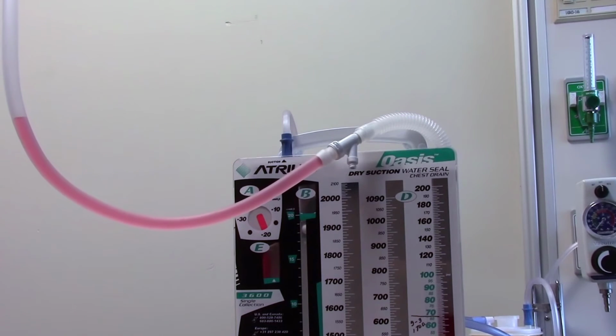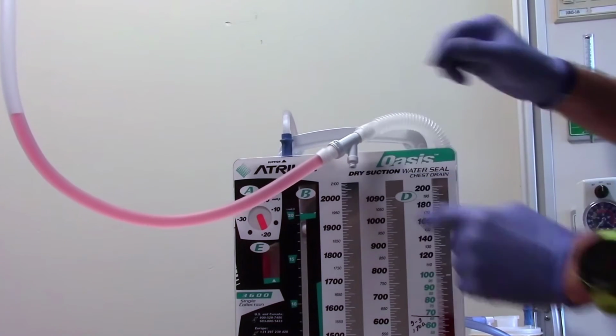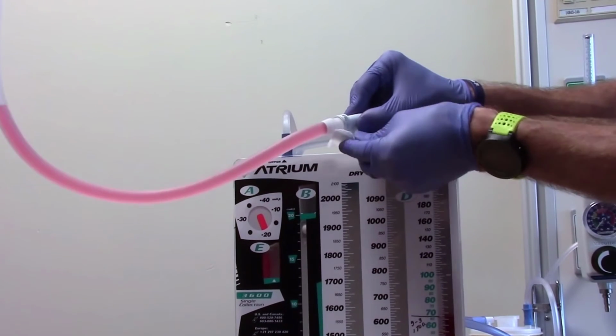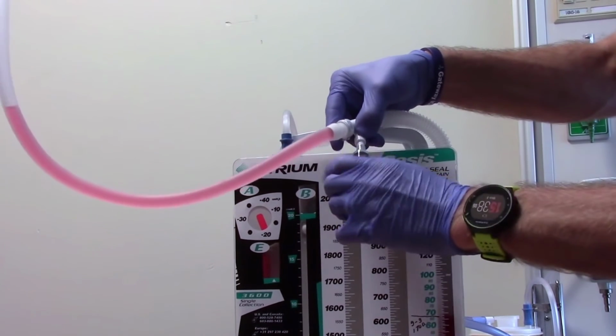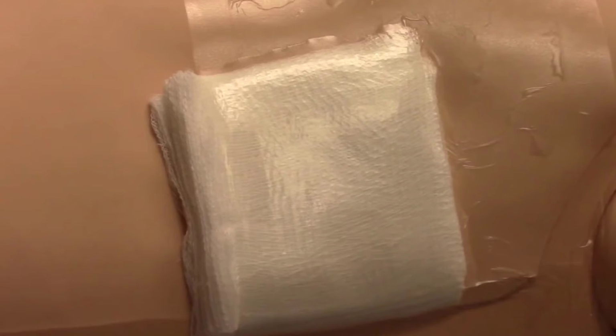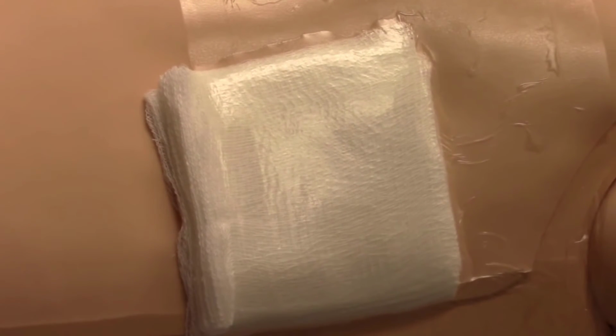If you need to collect a sample of fluid, there's a convenient sampling port here. Per policy, clean for 15 seconds. Apply a sterile syringe and get your sample.